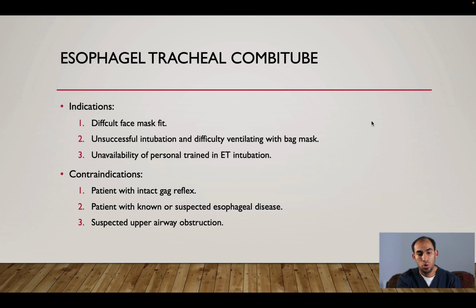Now we will go to the Combitube. What is the indication of the Combitube? Difficult face mask fit, unsuccessful intubation, and difficult ventilation with a bag mask. The third reason is unavailability of personnel trained in ET intubation.